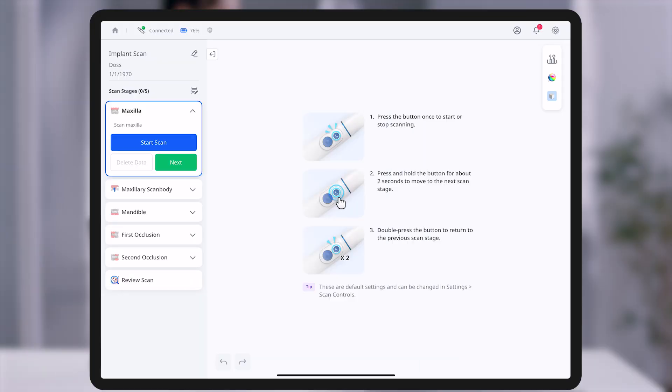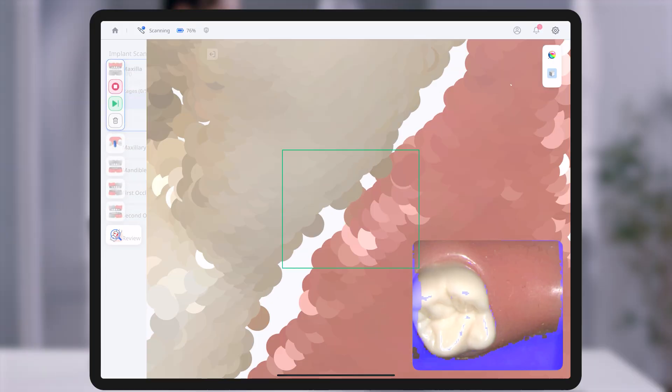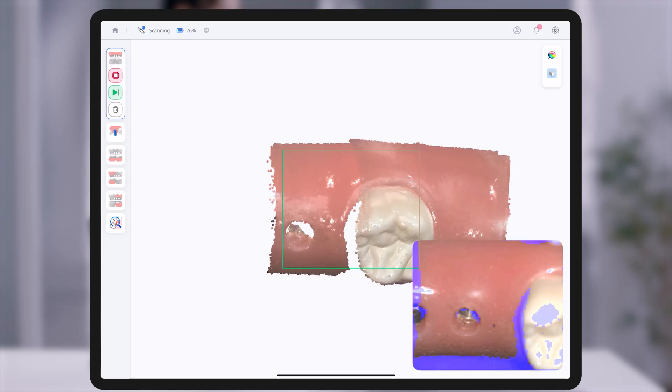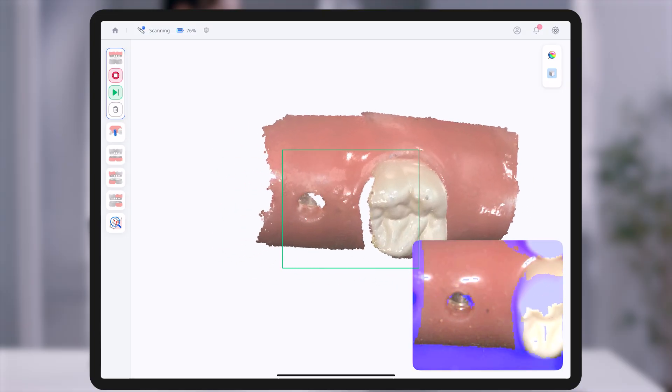Once the workflow is selected, you may begin scanning. Each scan stage can be initiated by tapping the start scan button or using the handpiece button.